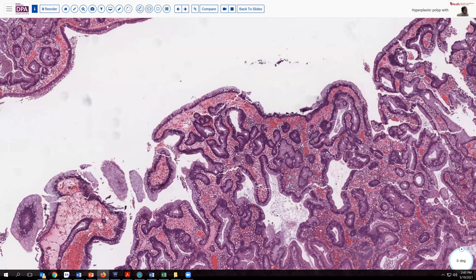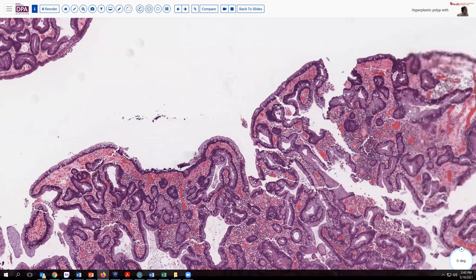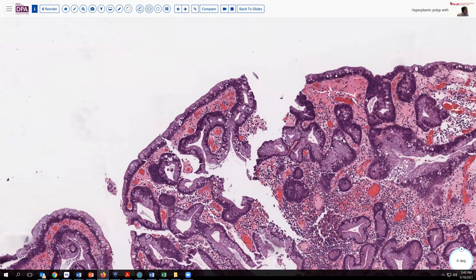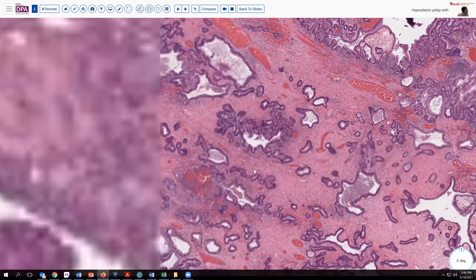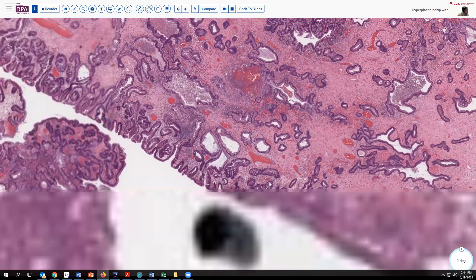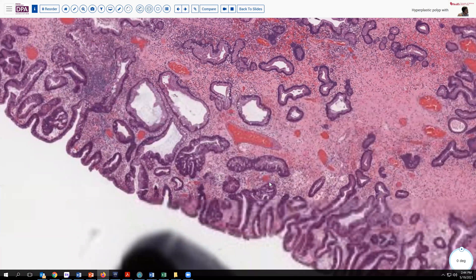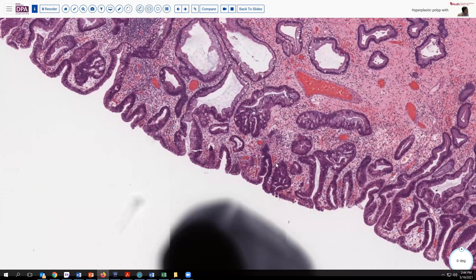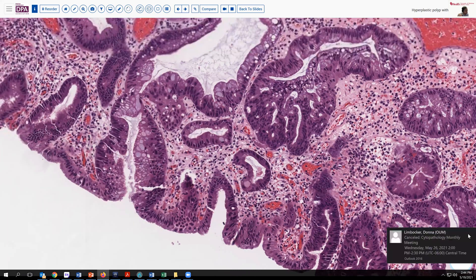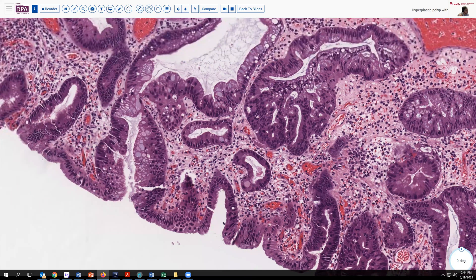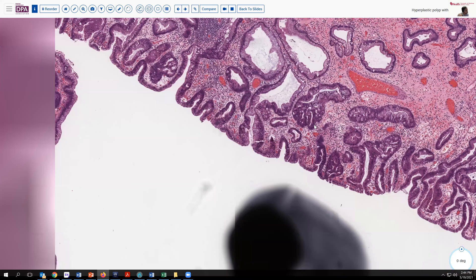When looking for dysplasia in these lesions, we're looking for features that resemble dysplasia seen elsewhere in glandular epithelium of the GI tract: nuclear crowding, hyperchromasia, and loss of polarity. Here at the dot my colleague has provided, we can see one of the hallmarks of dysplasia — architectural complexity. We see crowding, loss of adhesion to the basal lamina, and hyperchromasia. Here's another gland beginning to show cribriform-type formations. These foci would qualify for dysplasia in this lesion.